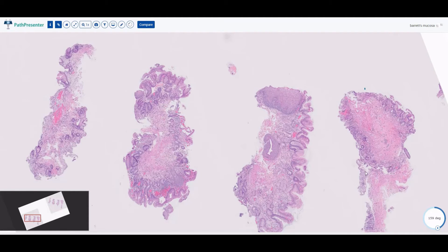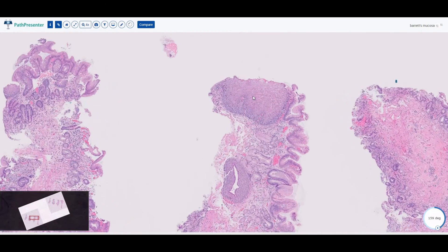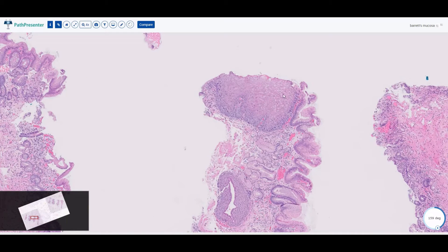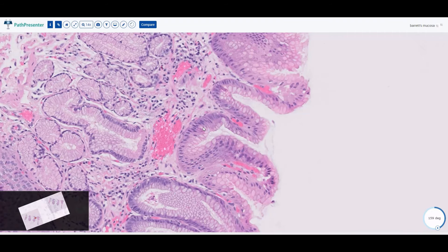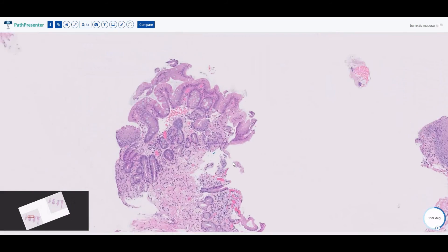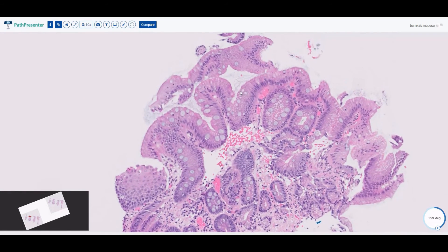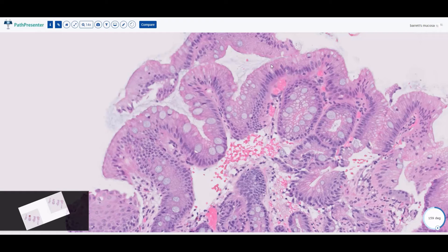Taken all together, you could call this whole junction squamous-columnar mucosa with features of reflux. Another very common thing that pathologists evaluate in the esophagus, especially around the GEJ, is Barrett's esophagus. Barrett's is a long-standing response to reflux esophagitis — when you have a lot of reflux and increased acid at the junction, the normal squamous mucosa doesn't like acid so it transforms more into foveolar epithelium, which helps the esophagus withstand long-standing acid.